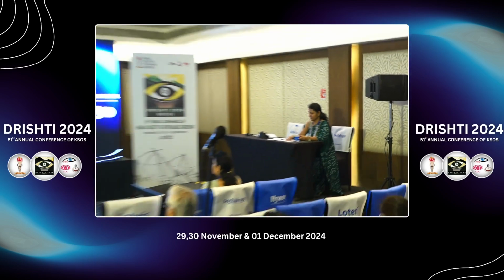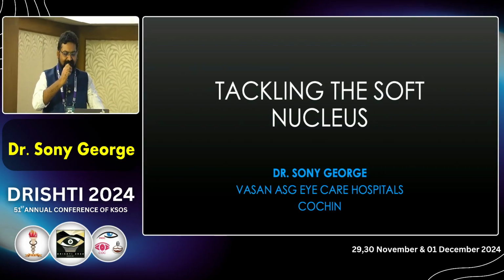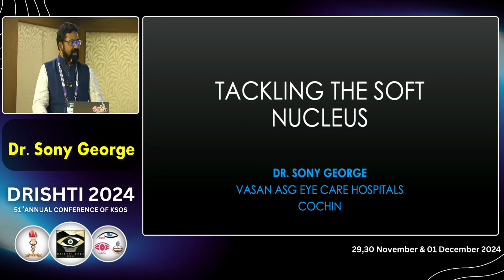Thank you, Dr. Vanishri, for the opportunity. Good afternoon. Just one comment on your small pupil IFIS cases. Maybe if you go a little anterior instead of near the limbus, by 1 millimeter, that could also prevent even the side port from the iris coming out.